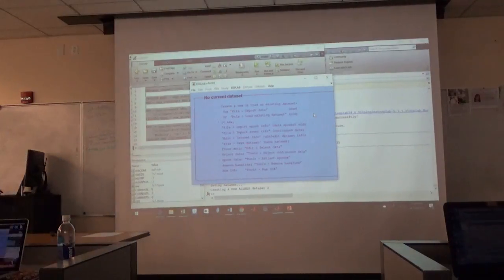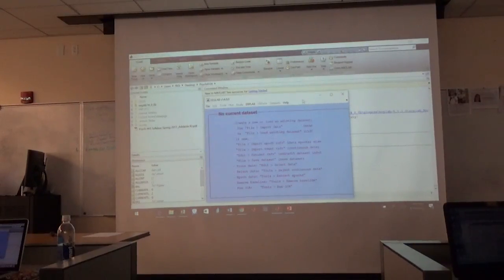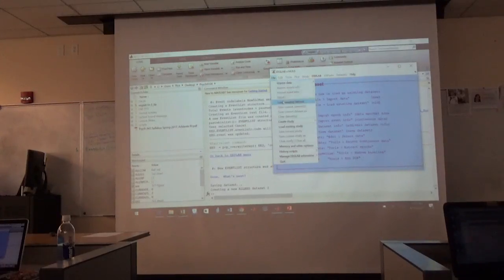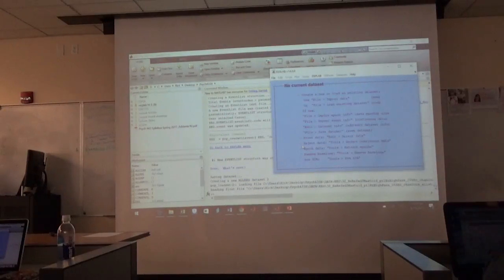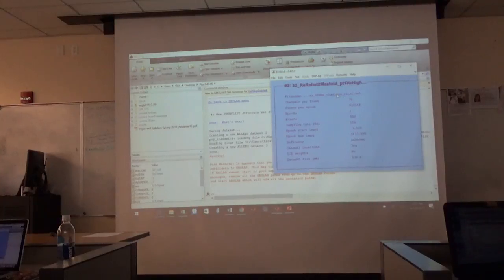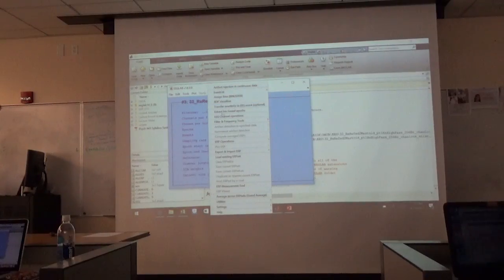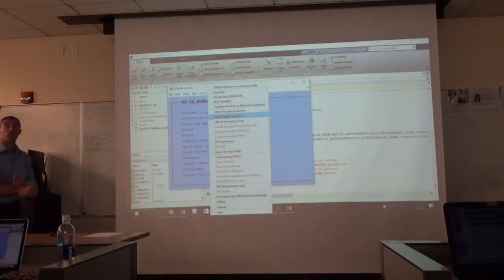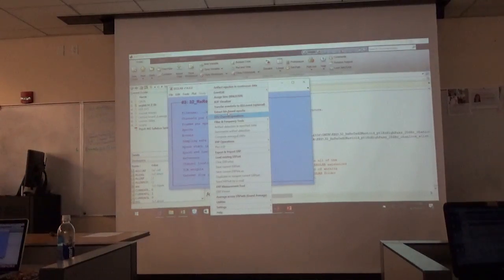So, anyways, let's see here. Does everybody have that events list file loaded? You should, because nothing should have changed from our break. So you have our events list. The thing we're going to do next is what we tried to do earlier. We're going to extract our bin-based epochs. Does it matter if ours is number 2? No, it doesn't. So, extract bin-based epochs.